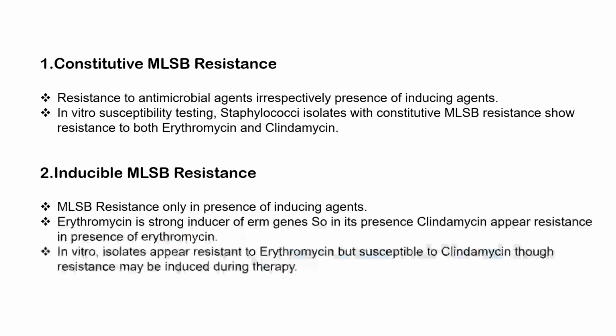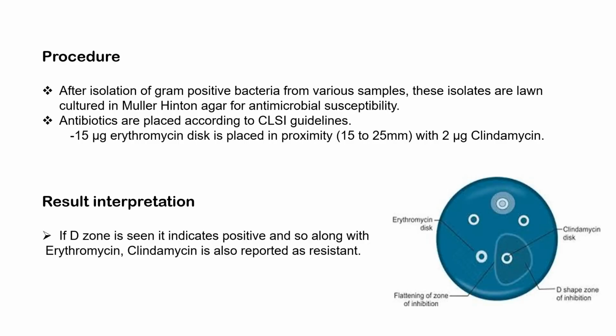So why do we perform the D-test? Because standard susceptibility tests may give false susceptibility to clindamycin. The D-test helps us detect hidden inducible resistance, ensuring proper antibiotic therapy.